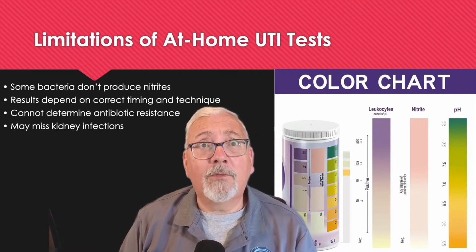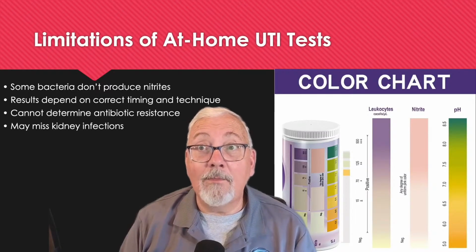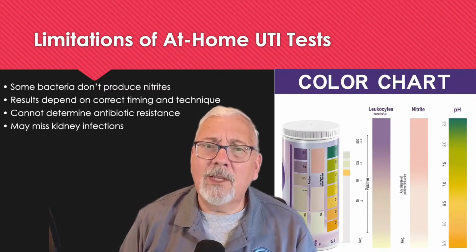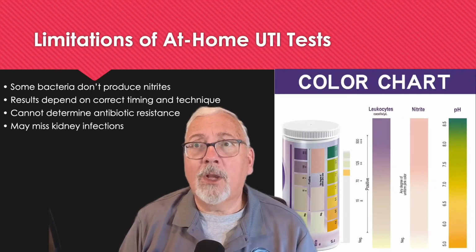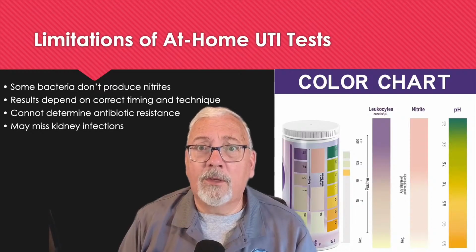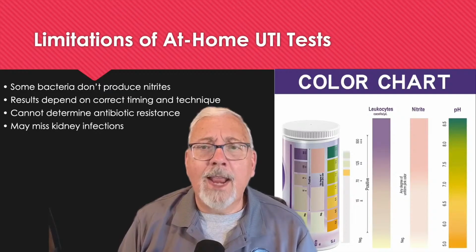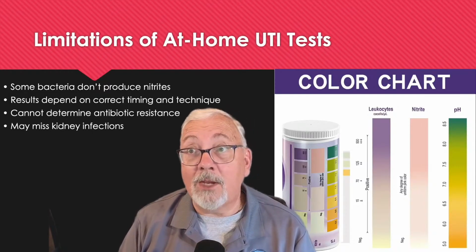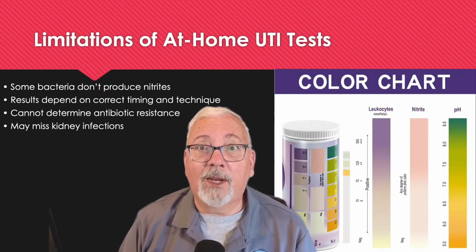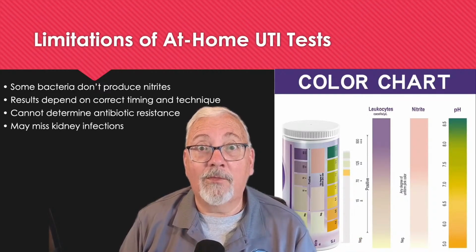Now let's talk about those limitations for UTI testing at home. Technique matters. If you don't collect the urine properly or read the strip at the wrong time, the results could be misleading. And these tests don't tell you which antibiotic you need, such as a culture would, where they test to see whether the antibiotic is going to kill it. But as you can see from this color chart here, it's really a simple compare: dip it and compare the color that changed to that chart. And depending on how much change, we know if there's more or less positive leukocytes or nitrites, those two things that we look at. I kind of mentioned there's other things that we can look at. Some of those test strips that I showed earlier have 3-4 different things they test for, like pH. Not really used much to determine whether you have a urinary tract infection, but sometimes we could use it for other things. But leukocytes and nitrites are the two biggies that we want for infection.